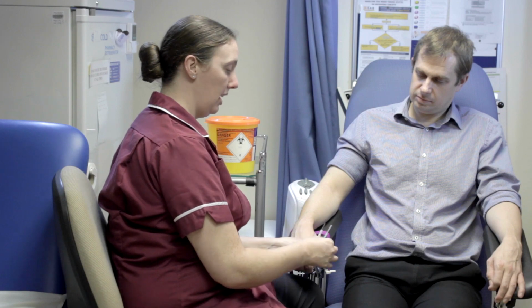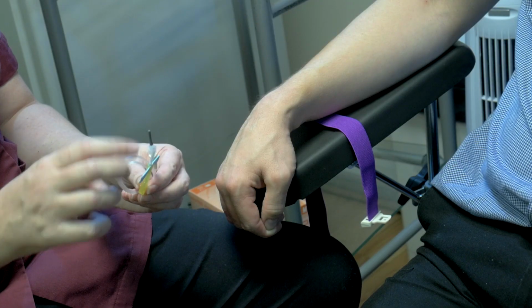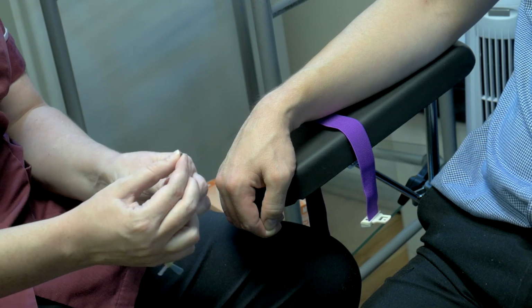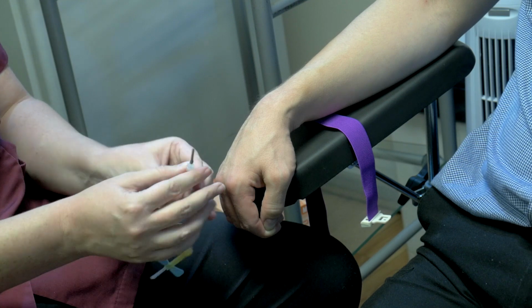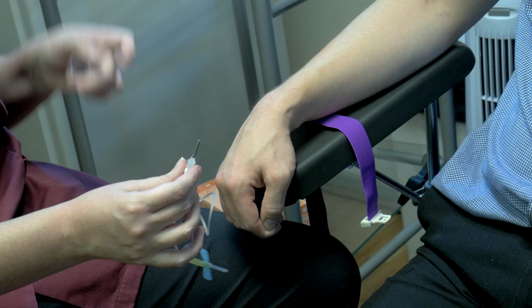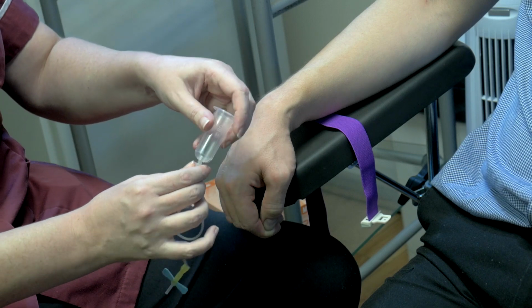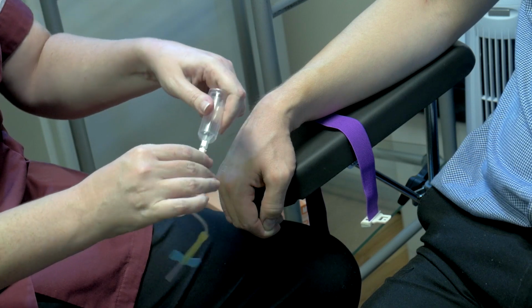In this case, it is not the one that goes into the patient. This is covered and quite safe. It is this side which goes into the holder, which has an actual needle inside. So although it looks nice and safe, you can suffer a needle sharp injury from this side just as well as any other. So we pop our holder on and twist it and give it a bit of a push.